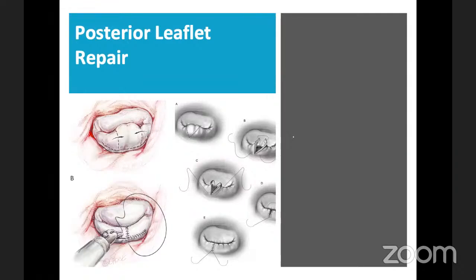Repair of the annulus and posterior leaflet can be accomplished with the same patch if the chordal support to the leaflet is good. Any patch needs to be sutured, and the suture line must be tension-free, with running suture 4-0 or 5-0 used for the entire patch. If replacement is required, mechanical or bioprosthetic, it may then be inserted after this repair on the same trigone patch.